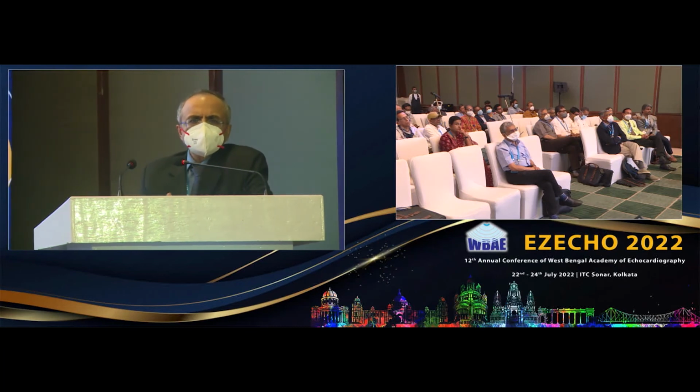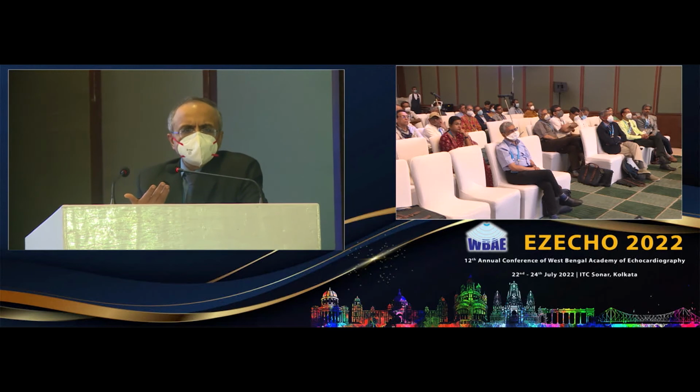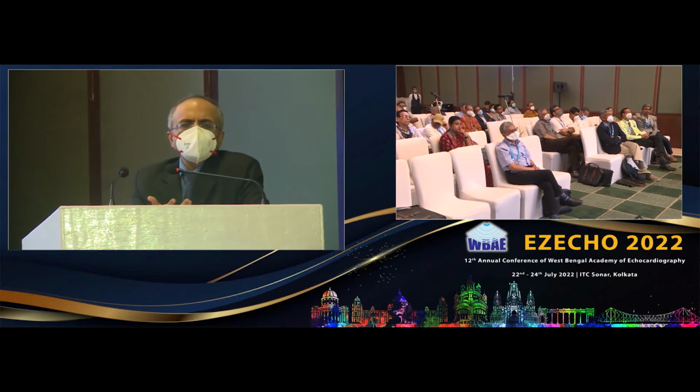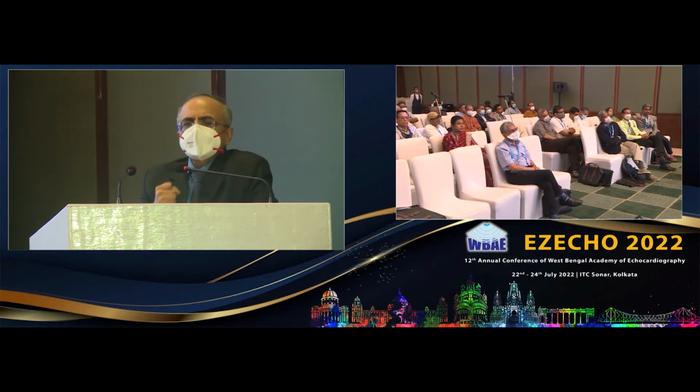So the first thing is very obvious: we have the ECG looking like an HCM, but on the echo we are really struggling to find hypertrophy, because there can be focal areas of hypertrophy which we may be missing. There the MRI will come in handy. Secondly, in some of these elderly HCM patients, the echo windows may be very poor. There I think the MRI can help.